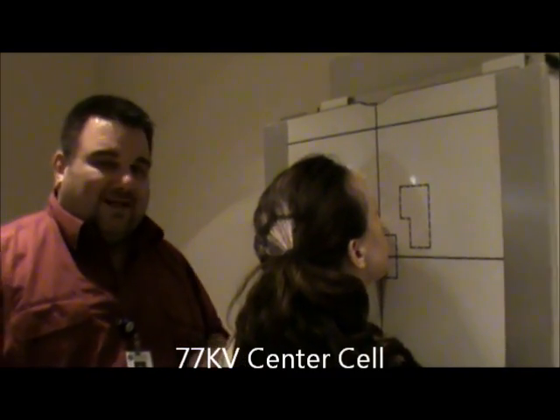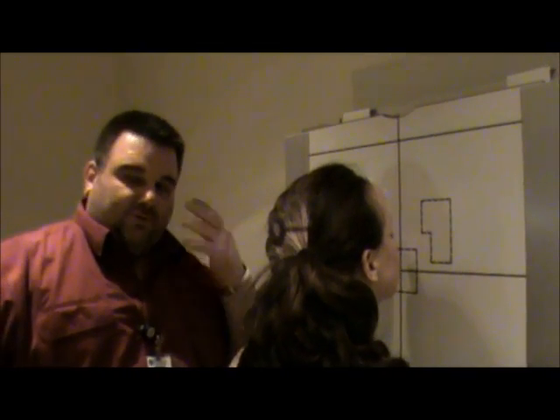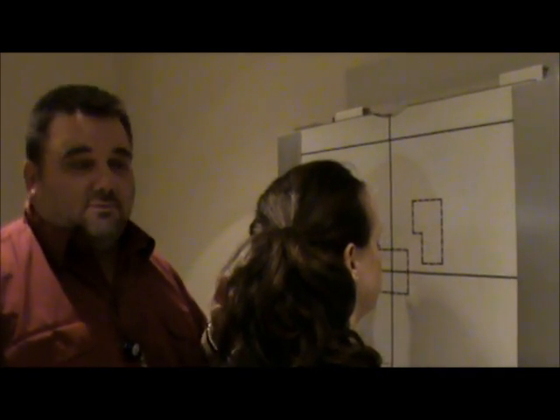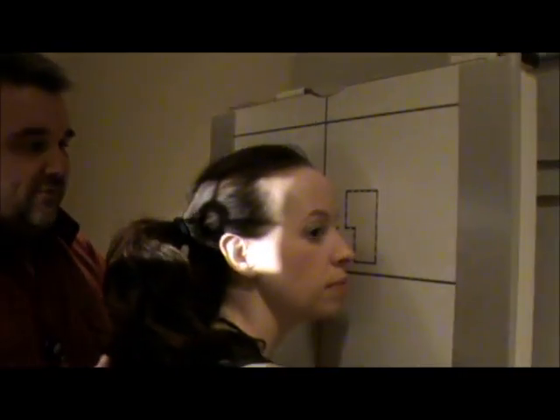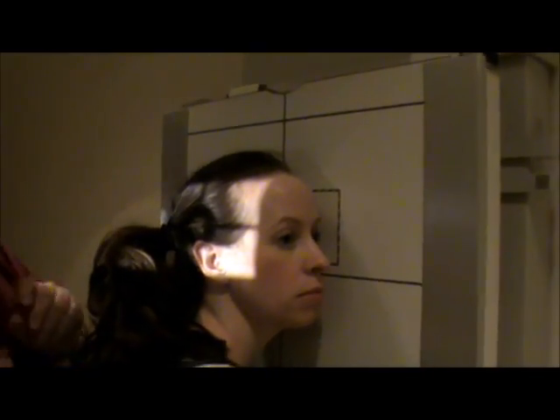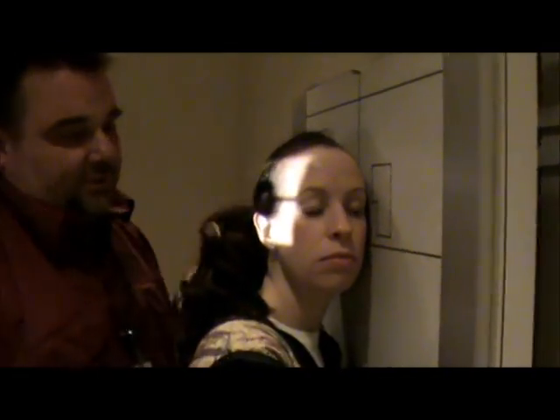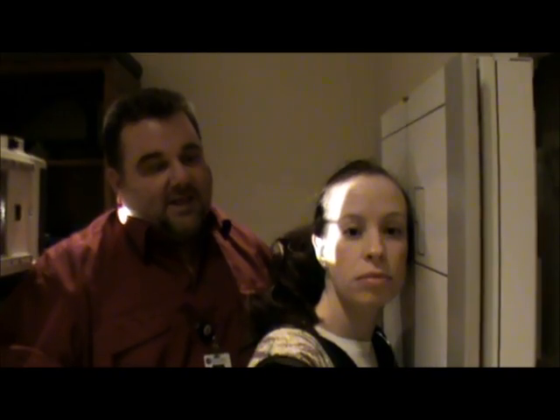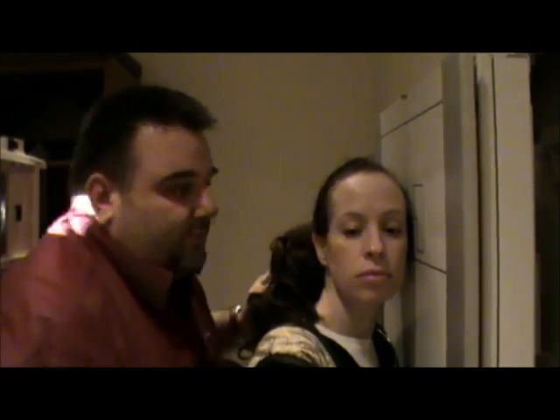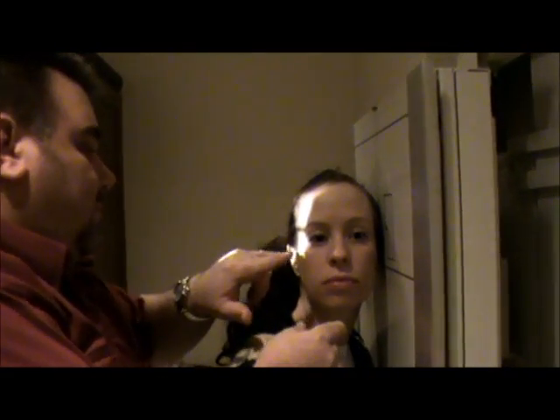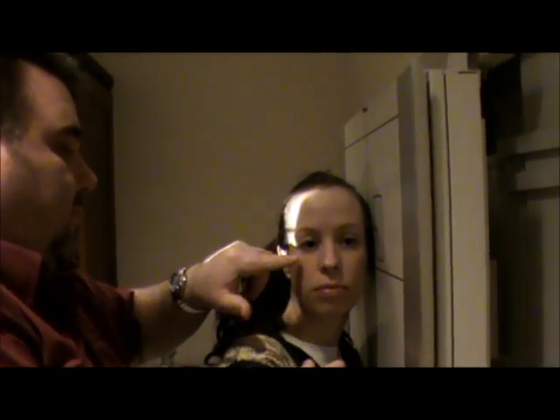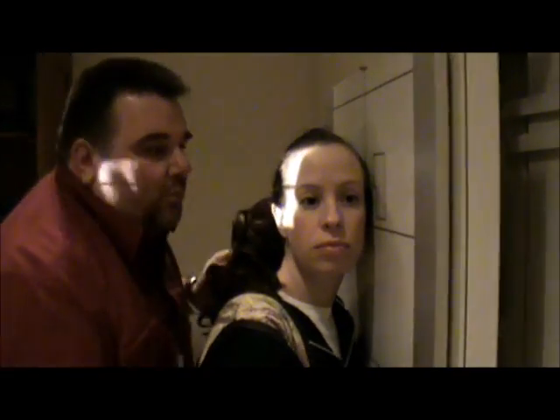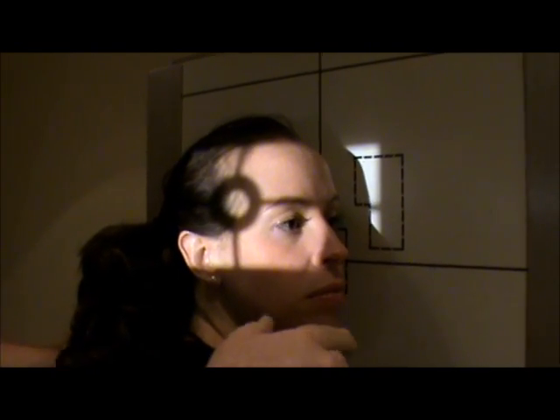The next view we're going to do is the lateral. You're going to ask the patient which is the side of interest — is there pressure or pain more on one side or the other? We're going to go ahead and do a left lateral. For a true lateral position, I want the IPL to be perpendicular to the IR, the MSP to be parallel to the IR, and the IOML perpendicular to the front edge. My centering is going to be between the outer canthus of the eye and the EAM.